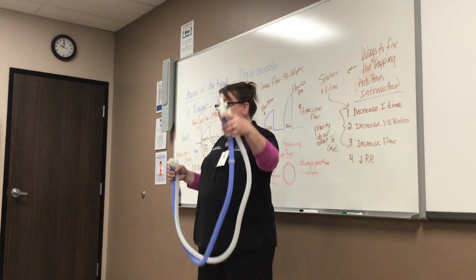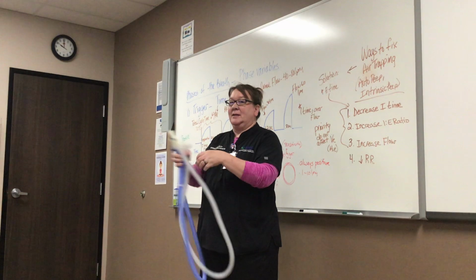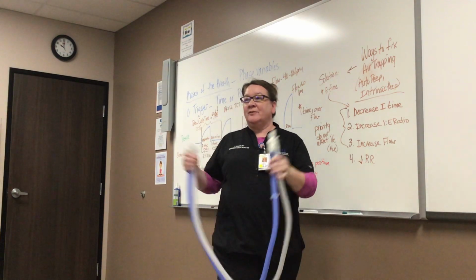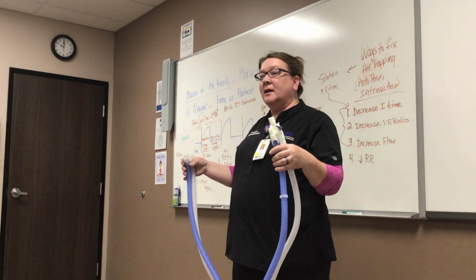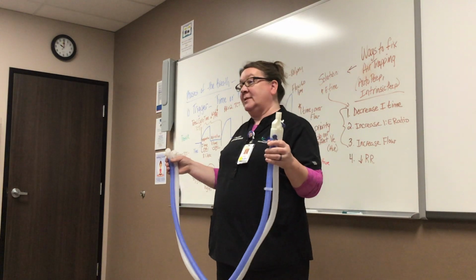Okay, right, so that everybody can hear that. Bias flow is continuous flow of gas responsible for replenishing O2 and removing CO2 from the patient circuit. So bias flow is nothing more than continuous flow going through your circuit. We call it bias flow, and it's called a couple other things. Some ventilators have bias flow. Most of the new ones do now.